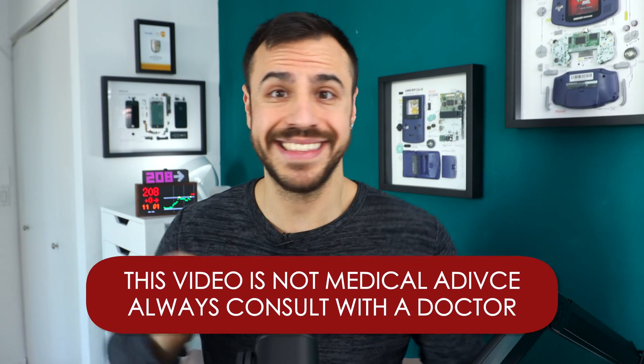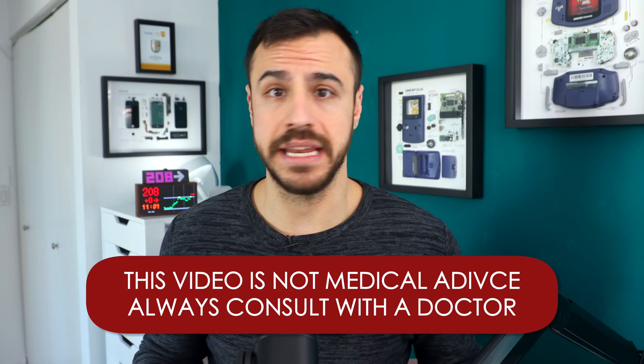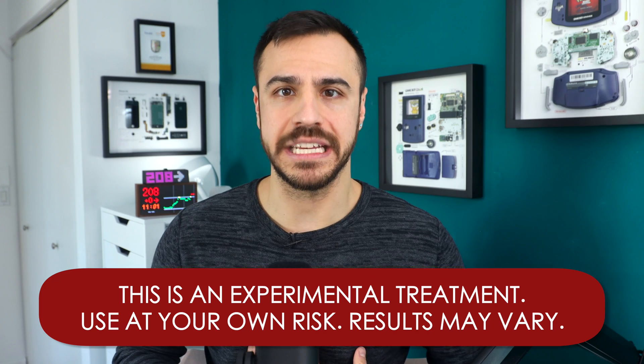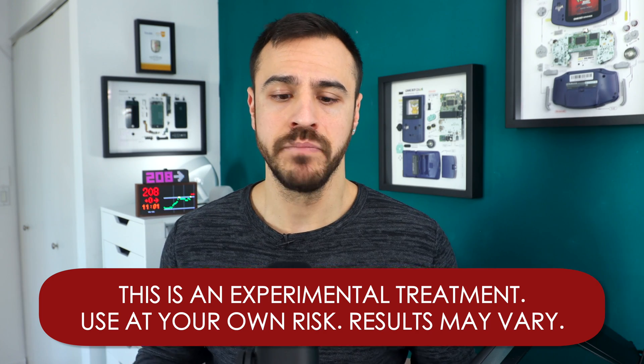This is not a medical recommendation. This is not medical advice. This is for educational purposes only and it's my experience using IAPS. You should always consult with a physician before making any changes to your healthcare. I just want to show you my experience using this, what I've learned, what I've taken from it, and hopefully help you if you decide to go this route, better understand IAPS and what to look out for when you start it.